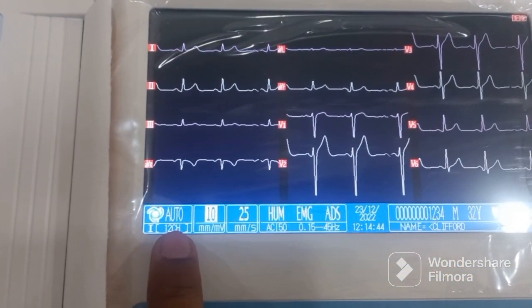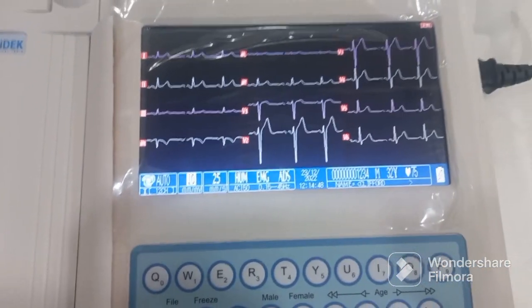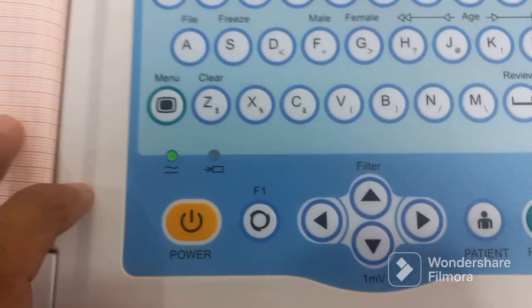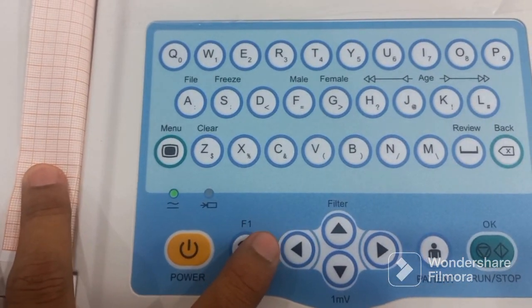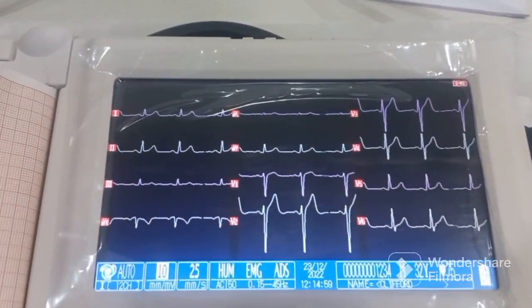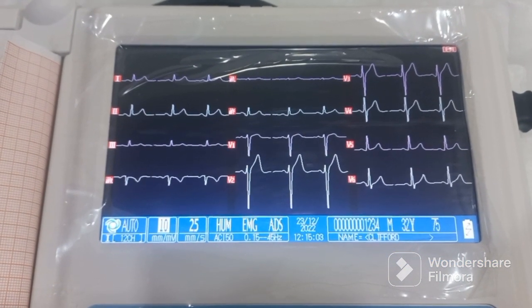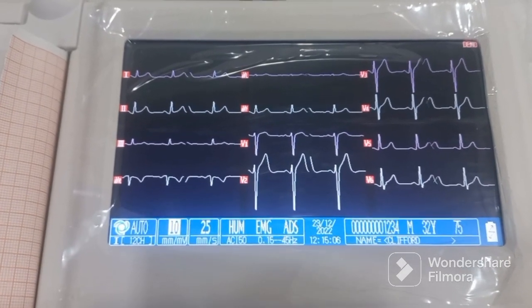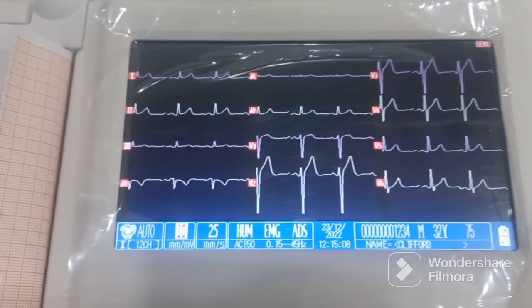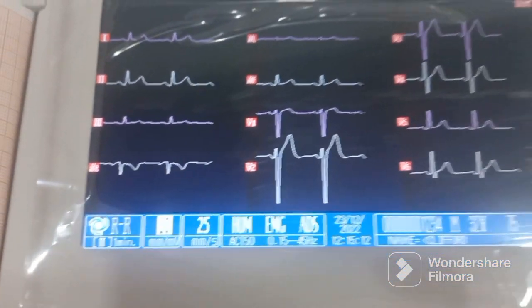This is the mode the machine is currently running on. There is a mode button which you can press to cycle through the four modes. The first is auto mode, in which the waveform analysis and interpretation everything works automatically — this is the best mode to use.